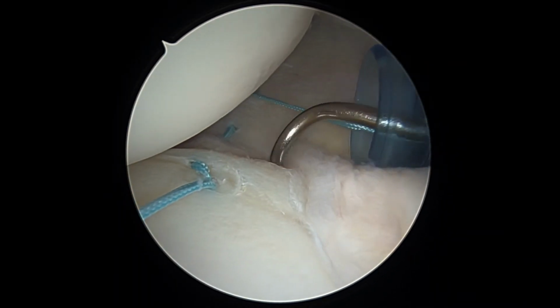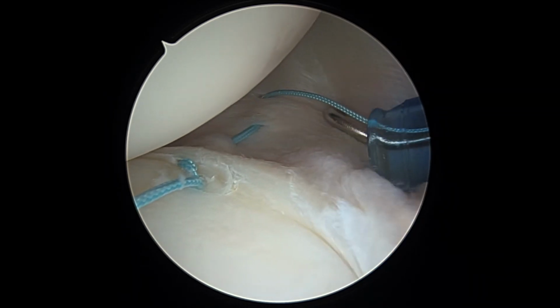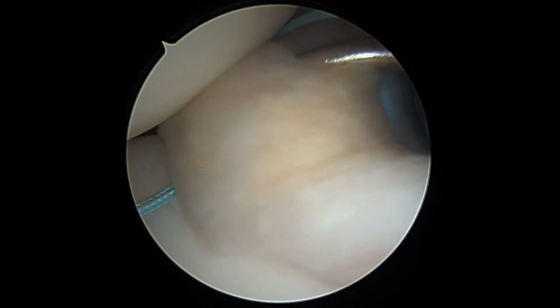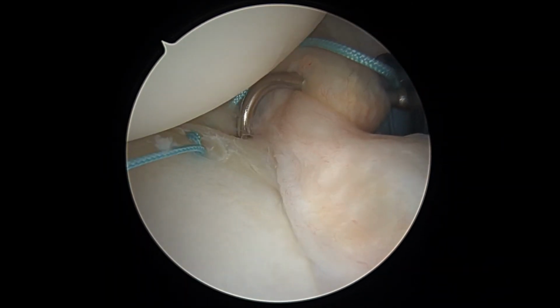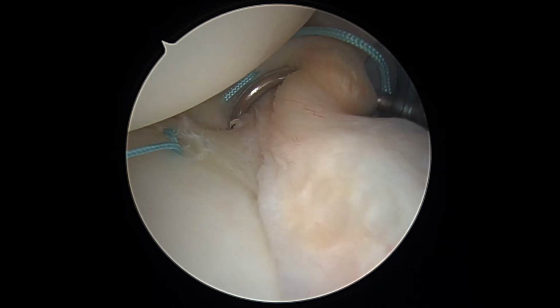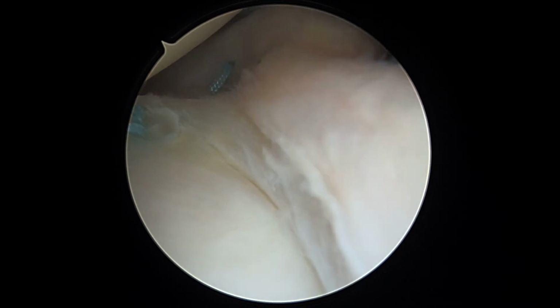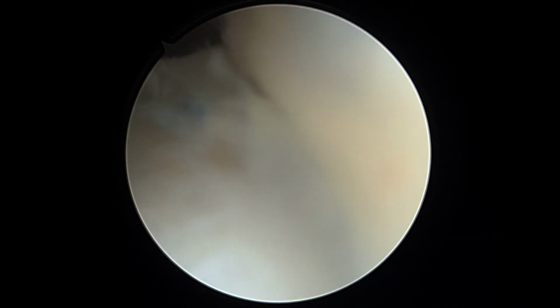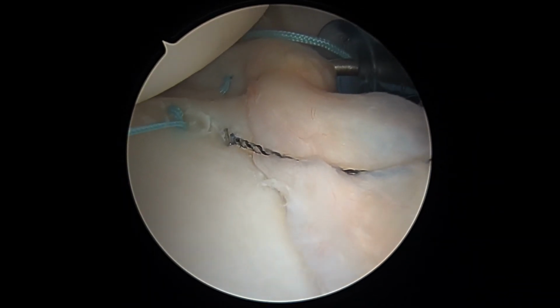Okay, so here we are making our second stitch. You can see we want a little bit of spread between the two. This one is technically on the superior side of the inferior glenohumeral ligament. Okay, there's our good bite of the capsule. And we'll use that as our anchor point right there.